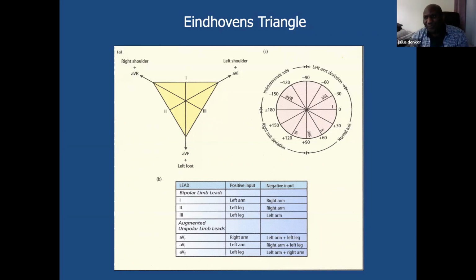Yeah, so I'm not sure who originated it, but we do have an algorithm called QuickOpt, which is to kind of evaluate what the LV-RV offset timing should be. And we don't use actual surface EKGs. It uses EGMs and a surrogate of that, because one argument to all this is we don't know where the lead is placed half the time, right?